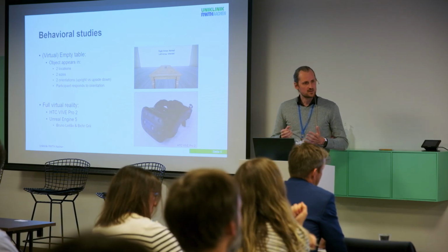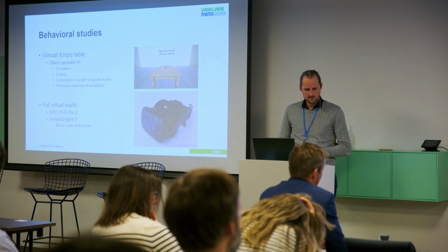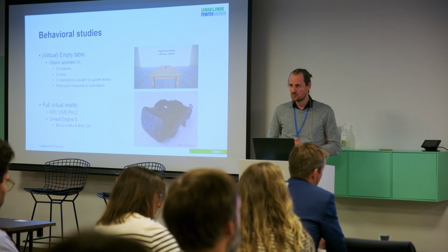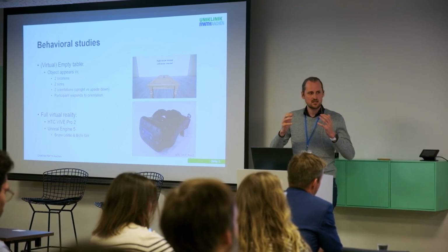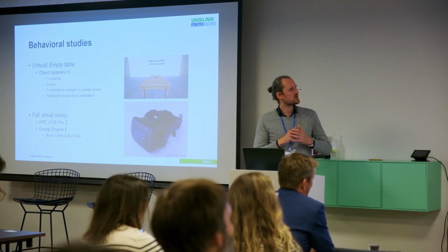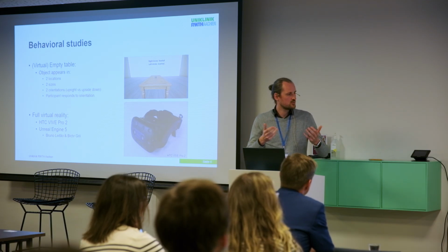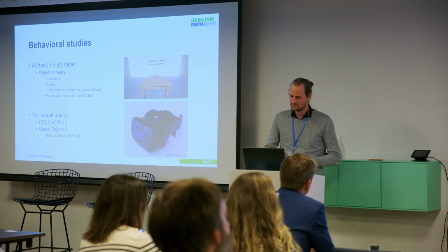We programmed our environment in Unreal Engine 5. Special thanks to Bruno Letau and Bichir Gri, our systems administrator and biomedical engineering student, for programming this for us. And using this, we were able to present relatively realistic looking stimuli. As you can see on the picture, we still prefer having quite basic stimuli without too much distraction. So it's always a trade-off between realism, immersion, and still having this clean research format, which we always like.